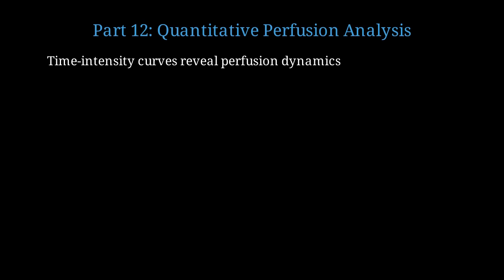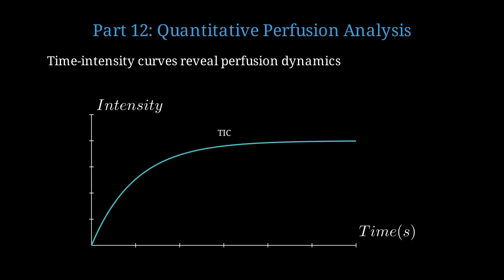Super-resolution ultrasound enables quantitative measurement of tissue perfusion parameters. By analyzing how contrast intensity changes over time, we extract quantitative perfusion parameters. This time-intensity curve shows rapid wash-in as microbubbles enter tissue, reaching a plateau representing steady-state perfusion.